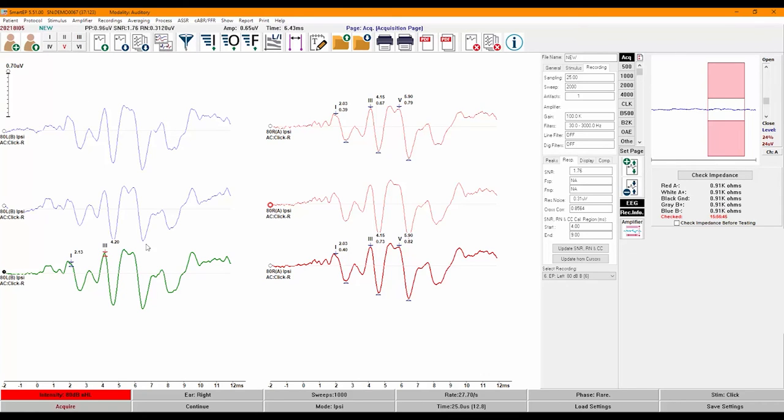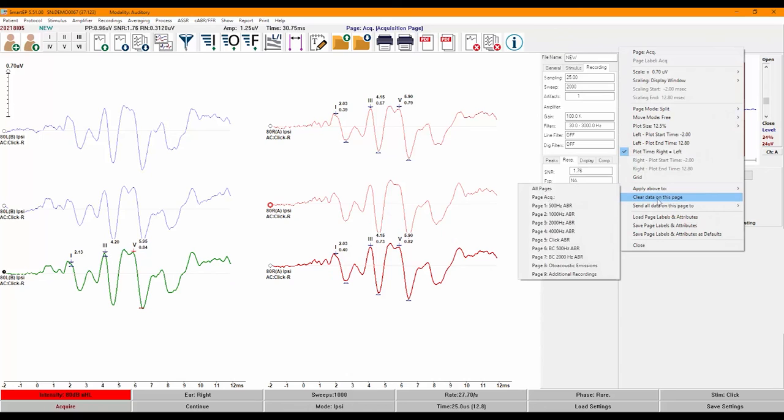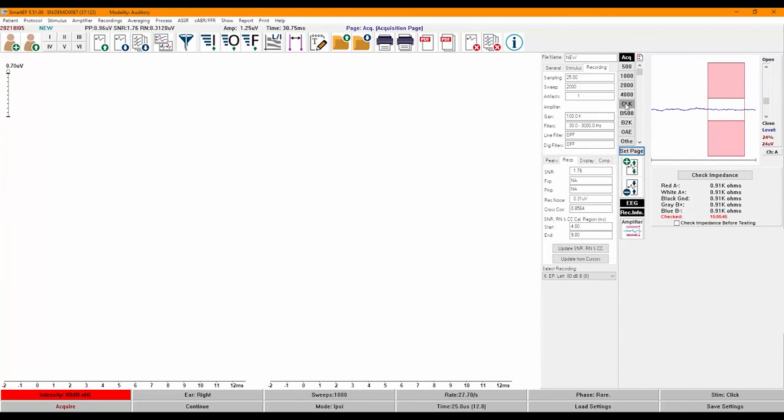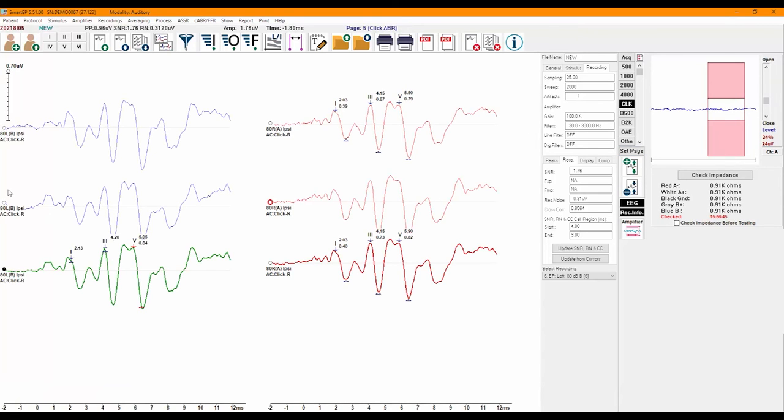Once you finish with one type of recording, you can easily move the recordings from the acquisition page to another page by right-clicking on the current page and selecting Send All Data on This Page to Page, then choosing your destination page. You can also use the Set Page button to do the same. This feature will move the recordings and all items on the page as arranged, making it easier to build your report.